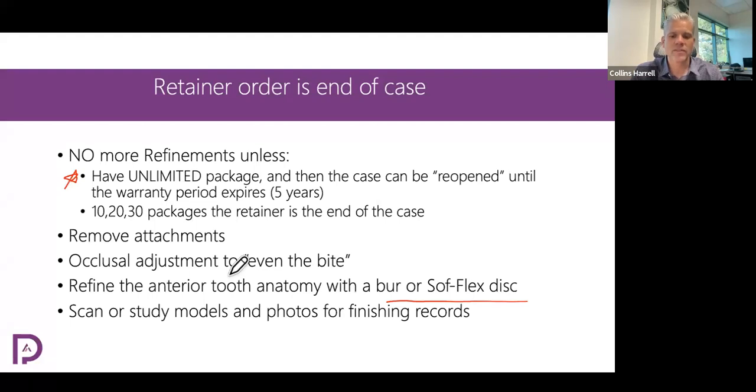And so we've accomplished this new position. The patient's been wearing aligners. They haven't had a chance to settle their bite in. So when you go through and check their bite, you might see that there's 1 or 2 cusps hitting harder than everything else, or a marginal ridge, or sometimes it's the lingual side of an upper anterior tooth where it didn't wear the same, like the mesial side didn't wear as much as the distal side. And so going through and just getting rid of premature contacts and trying to create a nice balanced, even occlusion, and doing that as you help them through their retention.